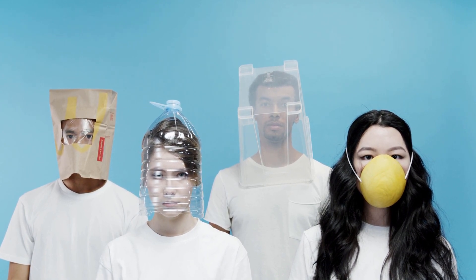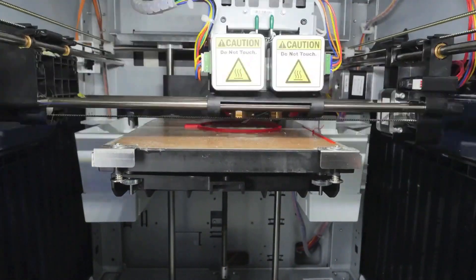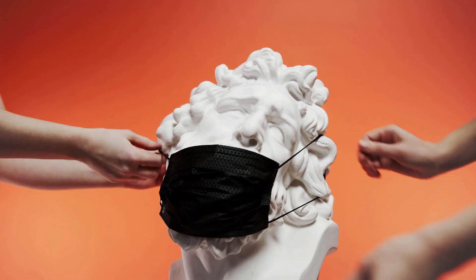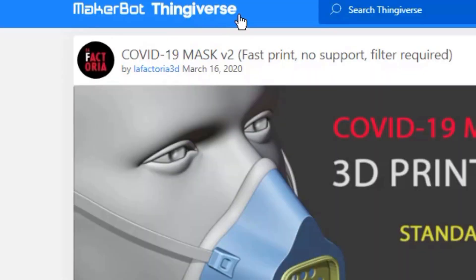That's why this video shows you how to make masks with a 3D printer so when you walk out of the house, you can have your 3D printed mask on so you can stay safe. Before I begin, I want to make it clear that the masks shown in this video are not FDA approved. This was not made by us, and it was found on Thingiverse.com. Specifically, it was made by LA Factoria 3D from Spain on March 16, 2020.